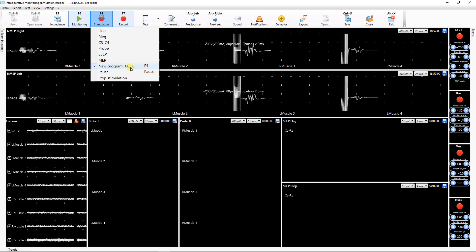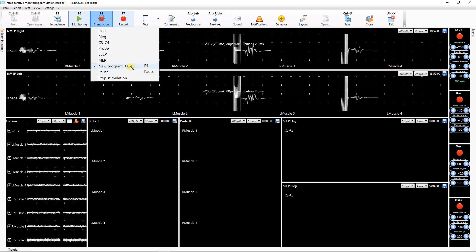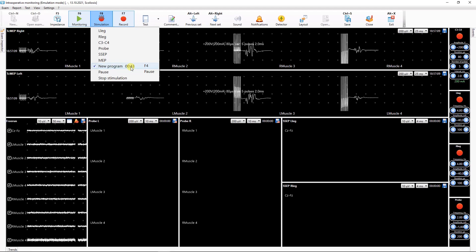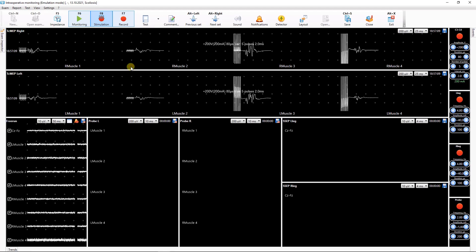If pause is on, the special countdown timer will show the time left before the Stimulation. You can stop Stimulation program by clicking it in the list or using a respective key combination.